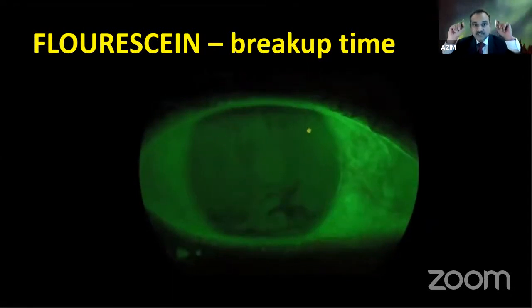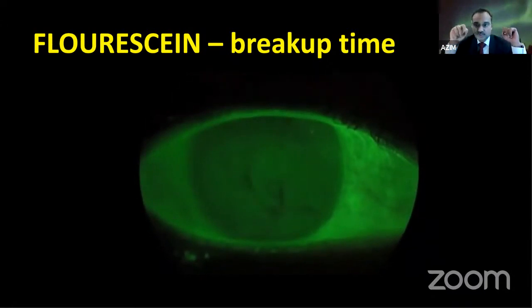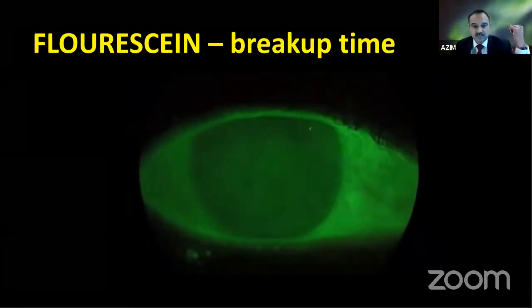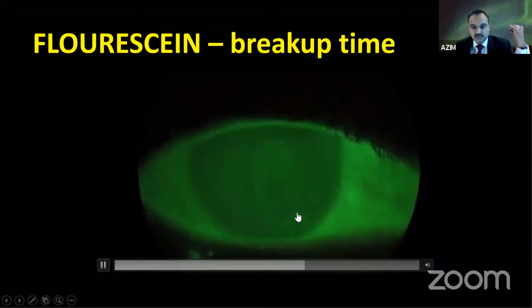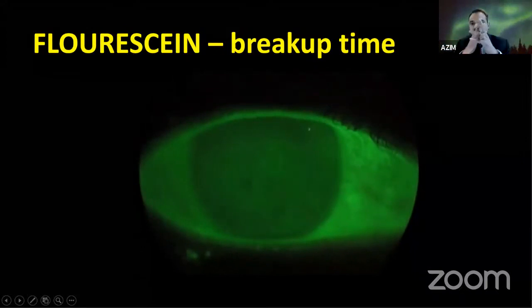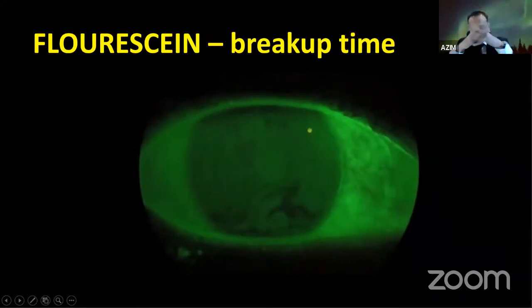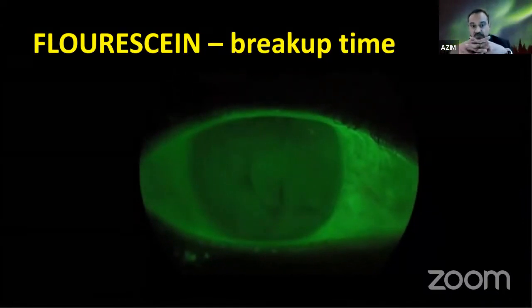So how do you know they're dry eye patients? You have to stain the tear film to see how it's working. So by putting a drop of fluorescein, it stains the tear film. Then the tear film, as long as it's in contact, it remains green like this. But when the tear film dries out in certain areas, you just watch here, it'll become black. So this is where the tear breaks up. So you have to assess the time where the tear breaks up. It's called the tear breakup time. So if the tear breakup time is very small, then the eyes are very dry.